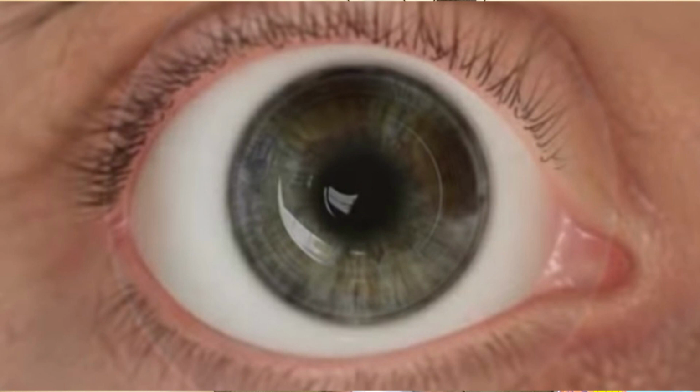Today we will be discussing femto-lasik surgery or femto-lasik laser. First of all, we will understand the steps that are involved in the femto-lasik procedure. Number one, the patient will come to your center for the surgery. The patient's eyes will be numbed with proparacaine eye drops every 2 minutes.